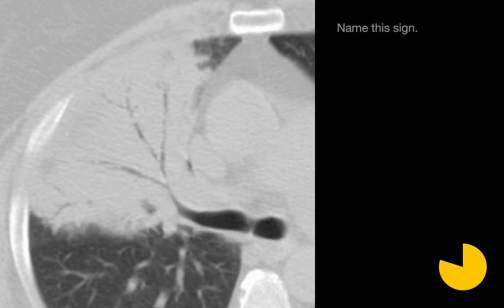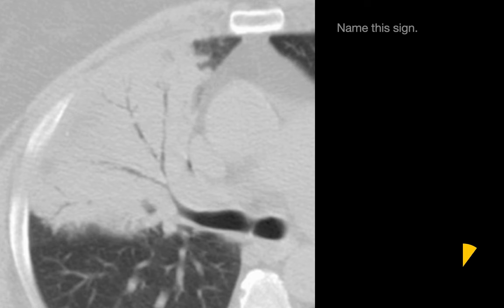Please name this sign. On this image we have linear lucencies that are branching, situated within a region of opacified lung. The sign we're looking for is an air bronchogram.